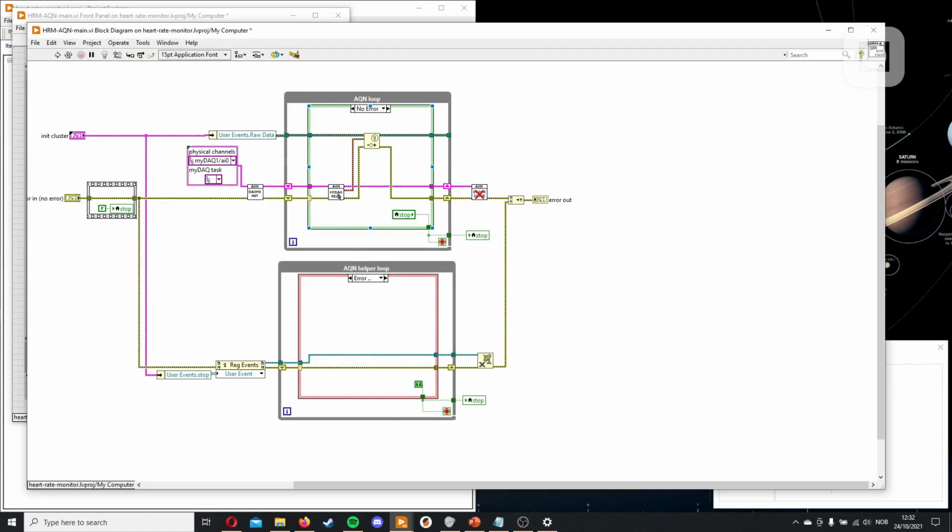So we could pause it from reading, but it doesn't really matter. Instead we'll just pause it from sending, because it can read as much as it wants, but if it doesn't send it to processing for analysis and then furthermore to the GUI, it doesn't really exist in our application. This is our helper loop, which receives external information. So we'll place it here and then transfer it upwards.